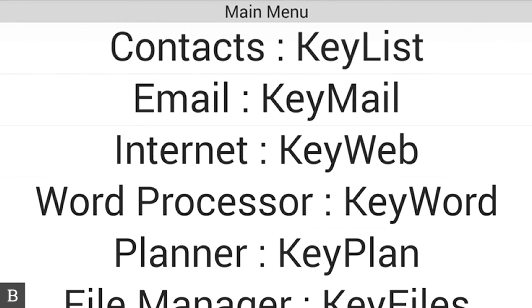Hello and thanks for tuning into another BrailleNote Touch Snapshot video. My name is Greg Stilson. I'm HumanWare's Product Manager of Blindness Products. In this quick video we're going to focus on how to send an email attachment through Keymail. Keymail has been the email client on the BrailleNote for over 16 years.